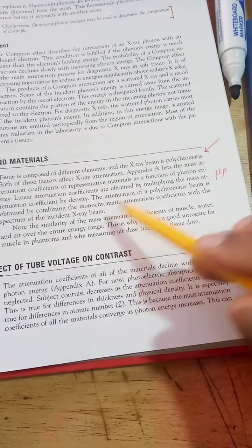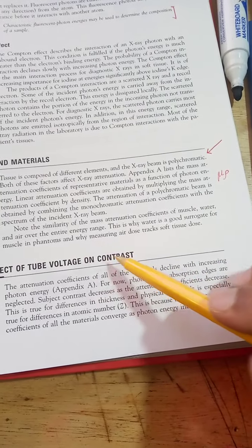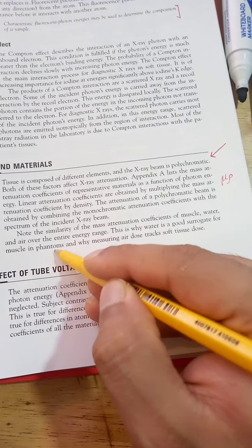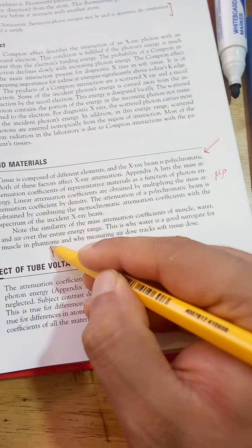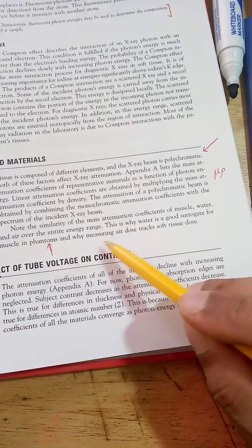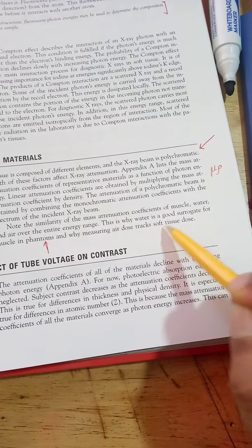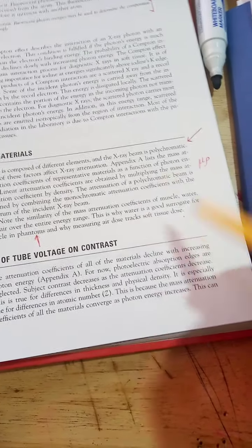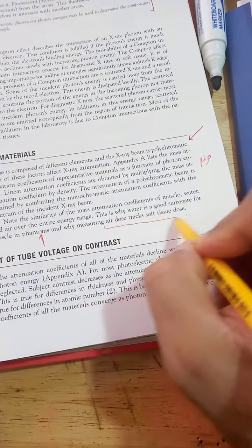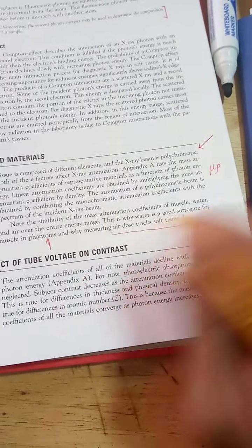Note the similarity of the mu of muscle, water and air over the entire energy range, which we did for iodine. This is why water is a good surrogate for muscle in phantoms. Phantom meaning empty statues used for research. Why measuring air dose tracks soft tissue dose. So, a bit of a tongue twister. Why measuring air dose tracks soft tissue dose.